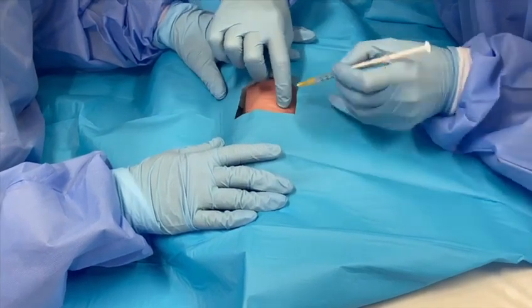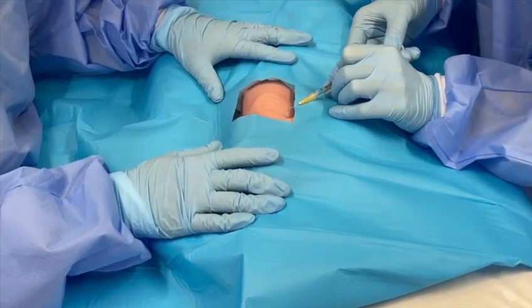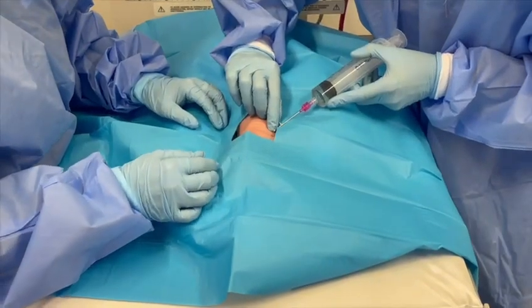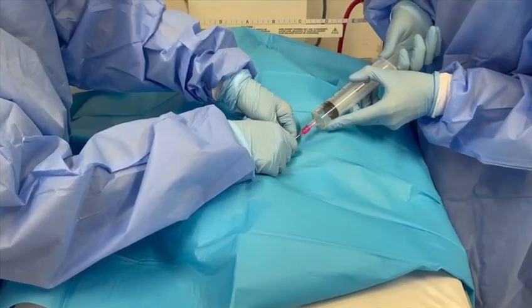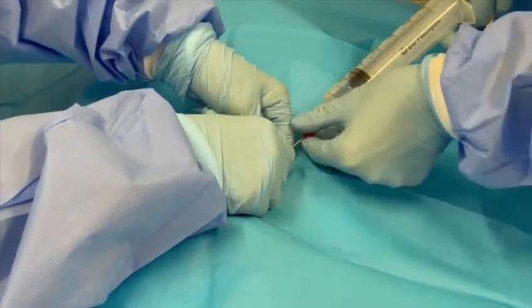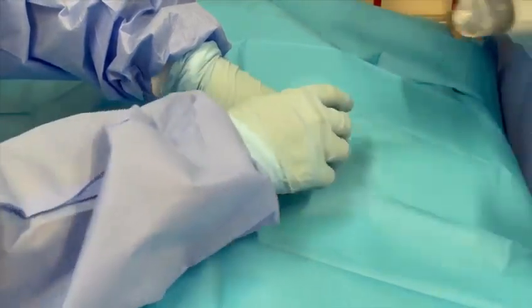Infiltrate local anesthetic in the mid-axillary line and allow to work. Connect the needle, which has been pre-marked, to a syringe with a small amount of sterile water to enable the air bubbles to be seen whilst aspirating. Advance the needle through the infiltrated skin, gently aspirating until air is obtained. Continue to aspirate if the pneumothorax is under tension.